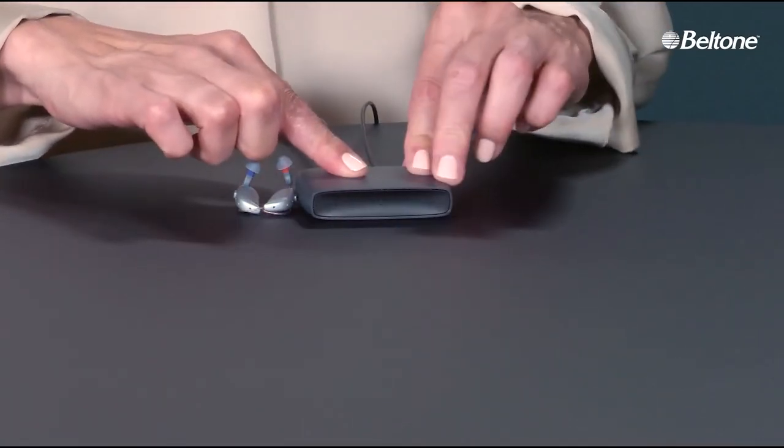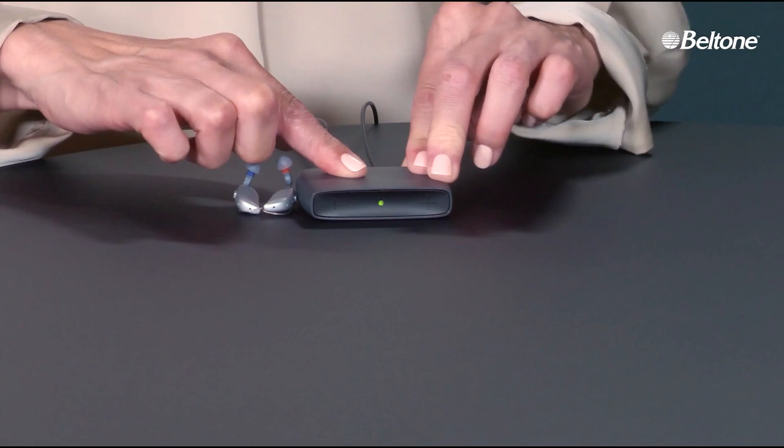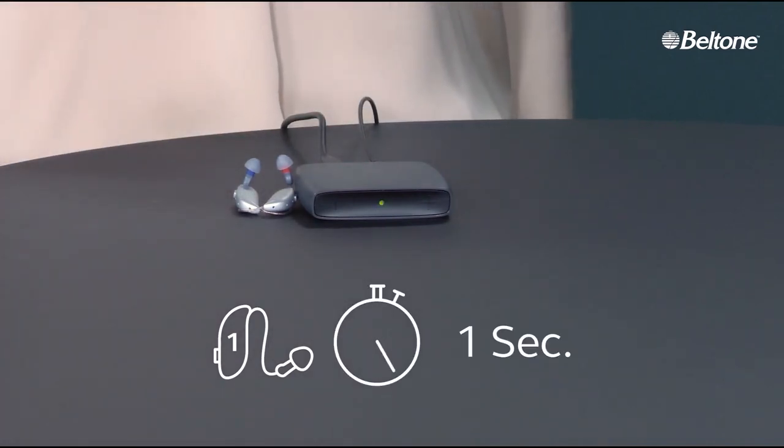The streamer is set back down next to the hearing aids. A right finger holds down the device from the top while left-handed fingers hold and press the left-sided button on the back of the device. This turns on a blinking green light in the front display of the device.